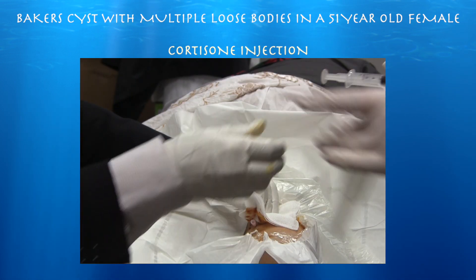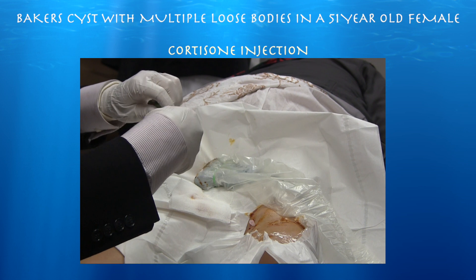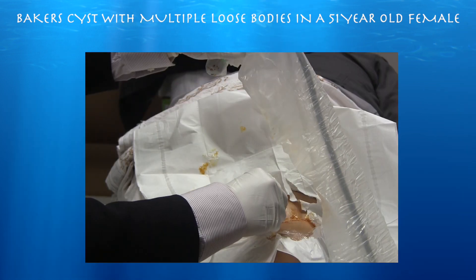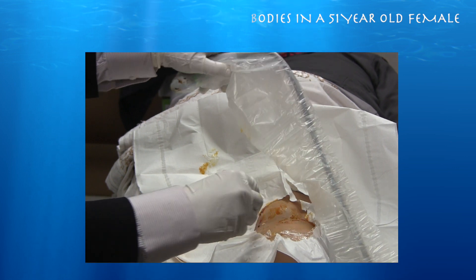Now we're just putting the cortisone in.